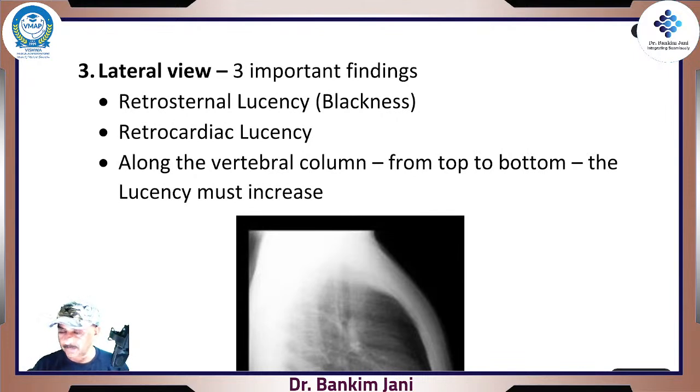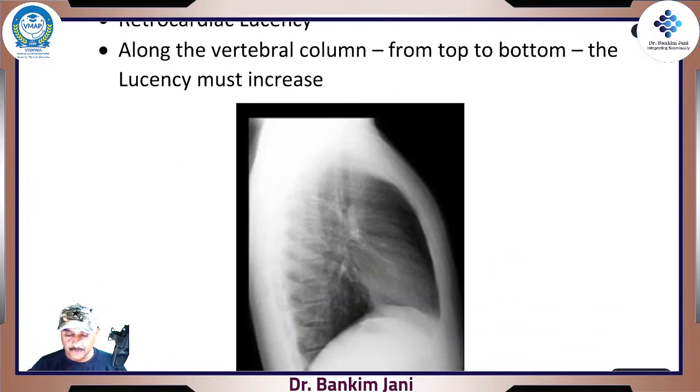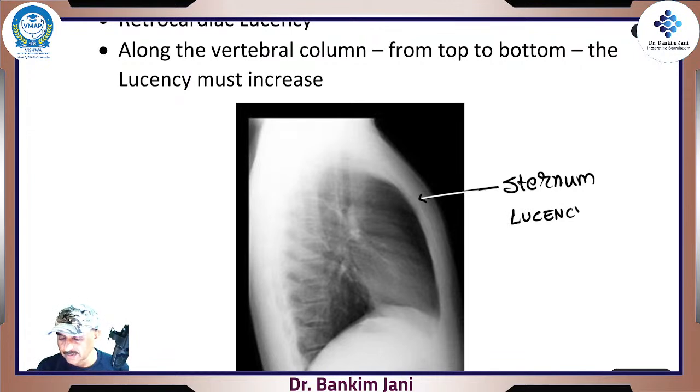Now we move on to the third projection, that is called the lateral view. Right, three important findings. One, the retrosternal lucency. This is the sternum. Whenever the word lucency comes, lucency means blackness.